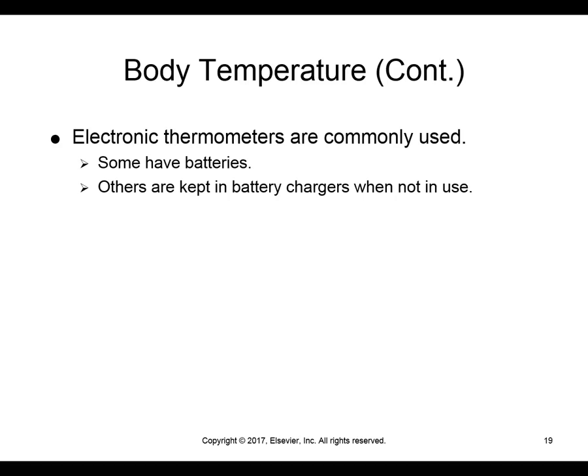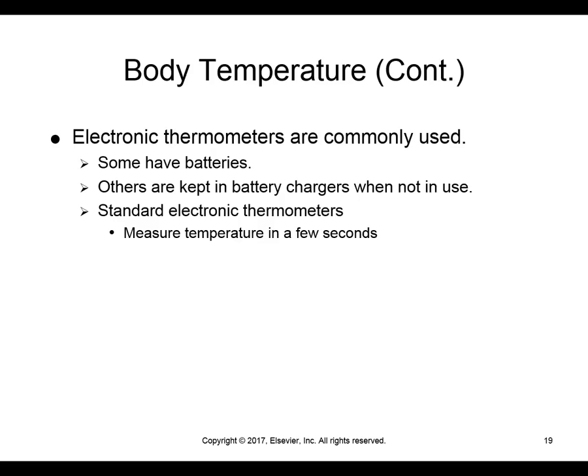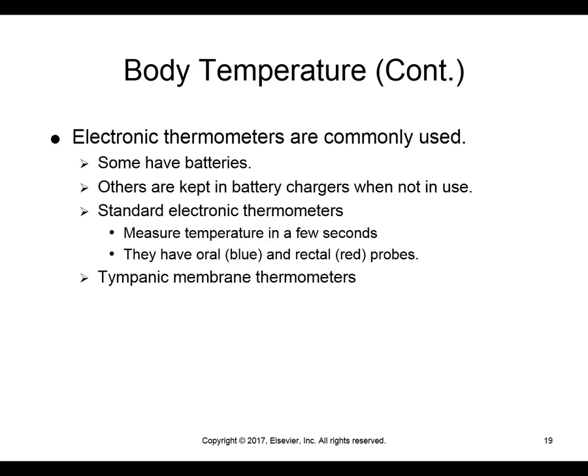That you don't leave it on a counter, because what can happen is the next person goes to use it and it doesn't have enough battery life, and they're not going to be very happy with you. So their standard electronic thermometers measure temperature in a few seconds. They have both oral and rectal probes, as I said earlier.